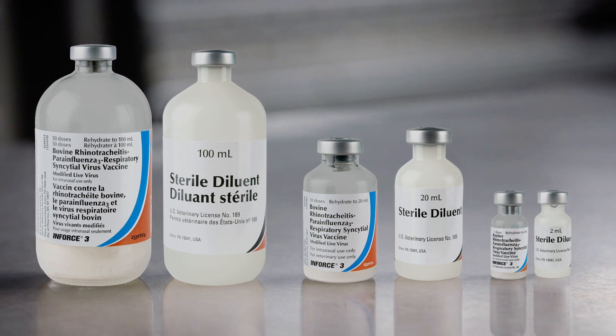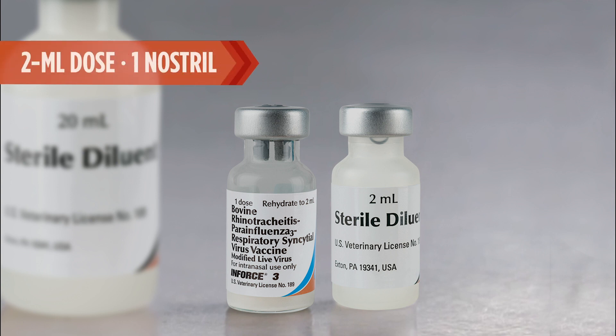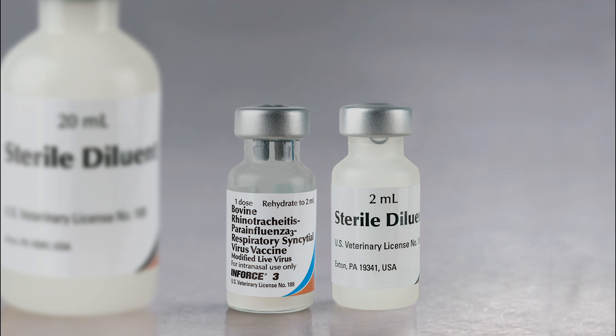The dosage for Enforce 3 is not dependent on the size of the animal. Therefore, all animals, regardless of weight, should be given a 2-milliliter dose into one nostril.